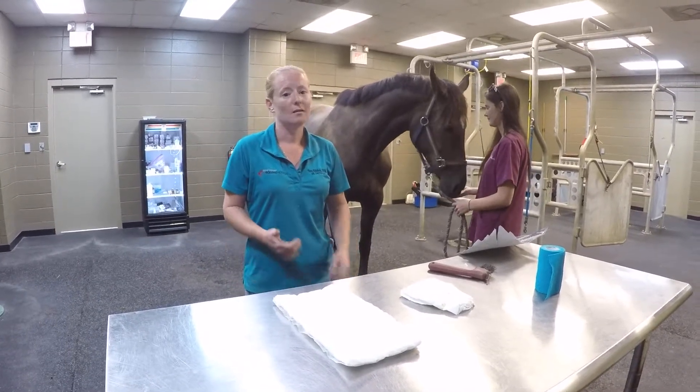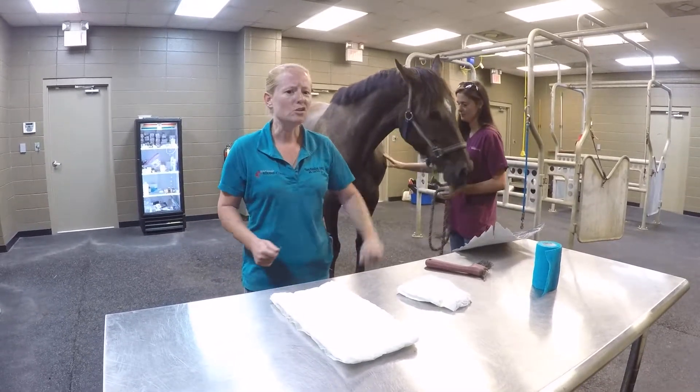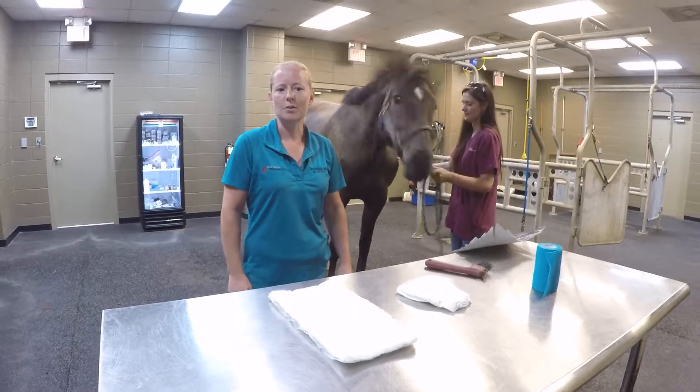Sometimes if they end up getting a crack in their foot, break some of the hoof wall away, or if they pull that shoe and take a little foot with it, that's another reason that we'll have you put a foot bandage on your horse just to give it a little bit of protection.